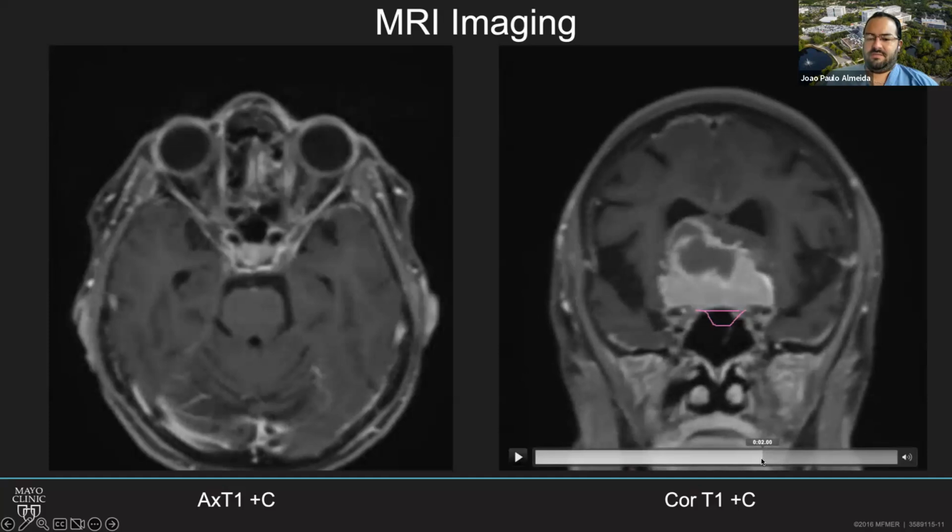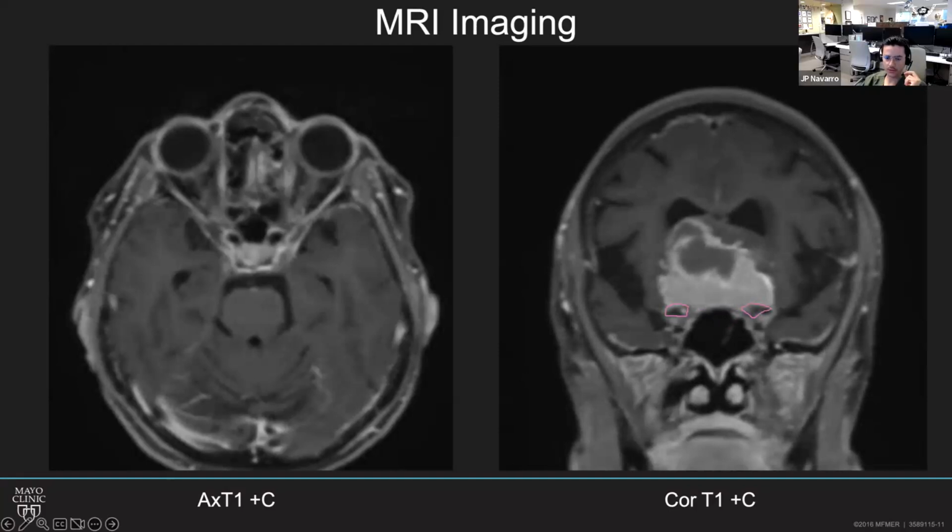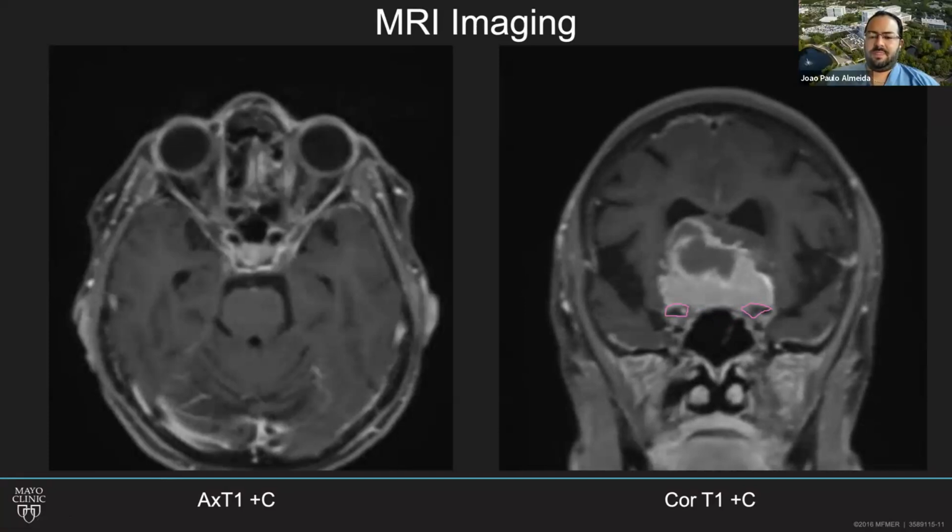Okay, stop right there. And then I'm gonna clear this just for a moment. And then you see, can anybody tell me what this is here and what this is here? These are bony processes. What is the name of this? It's the anterior clinoid. Anterior clinoid process. Okay.